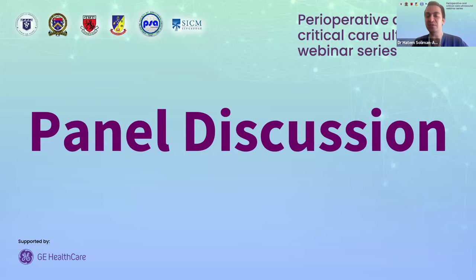So how I do preload assessment is, clinical assessment is the key. It's the foundation of our assessment. Clinical context matters: a patient in a general intensive care unit is very different from a patient in a complex cardiothoracic intensive care unit. A trauma patient is different from a patient who had a long bypass in cardiac theater. And at the same time, ultrasound integrates into clinical assessment, especially for preload assessment and preload responsiveness.